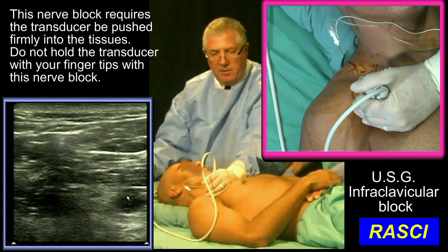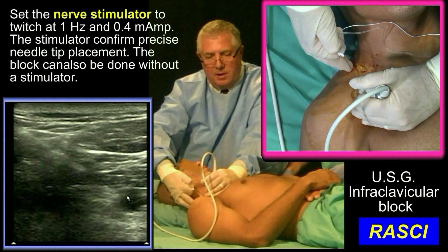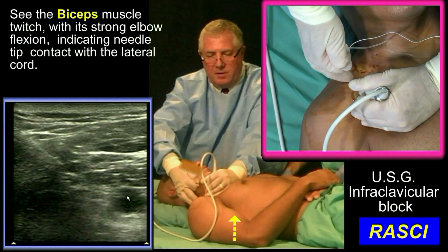I should be able to hold a very stable image. Now let's find the needling image. I rock the needle — it helps me see the needle. It's a little bit steeper. And I'm pushing in here to 9 o'clock.